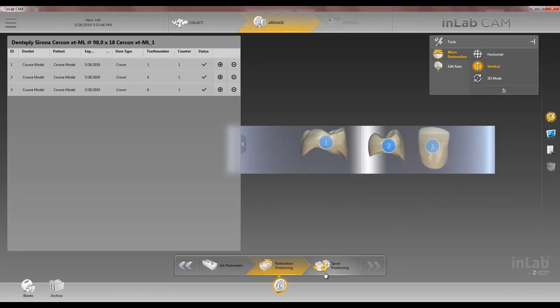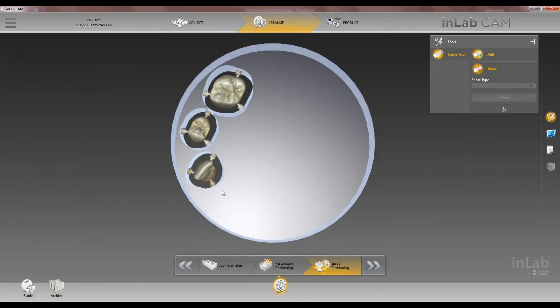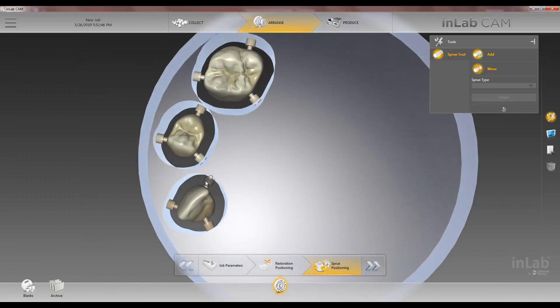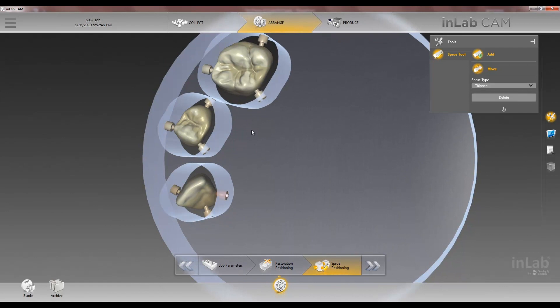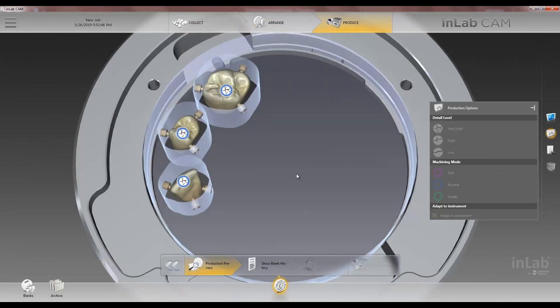Once we're happy with how much incisal we want, we'll go to sprue positioning. Position our sprues wherever you want, if you want to get them off of our contacts. Arrow forward, choose our production option, and we're ready to mill.